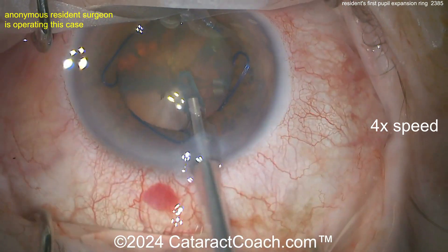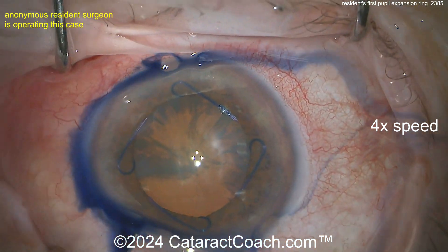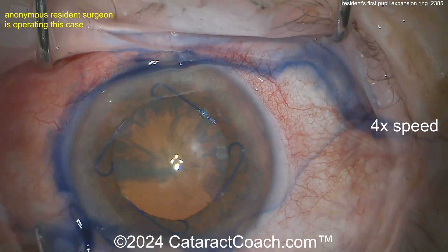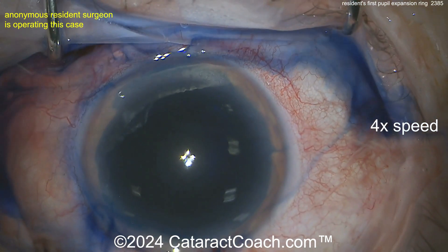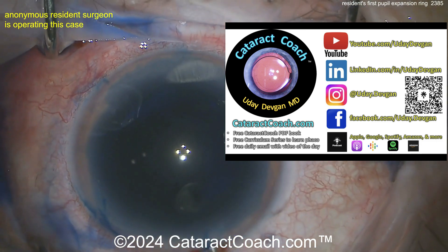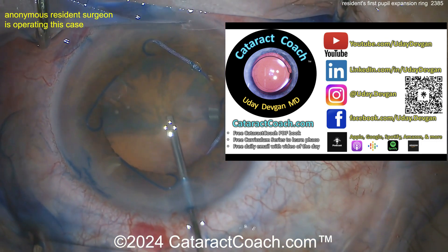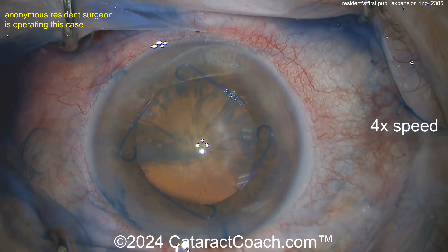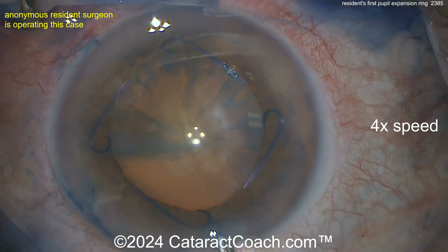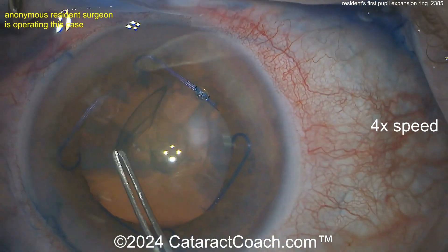You want to learn how to use these devices before you have that really tough case. Now aspirating out the viscoelastic, and you can probably put some trypan blue dye in there — there it is. Remember, if you're a young resident or registrar, there's a whole series of things for you on CataractCoach.com, including a free PDF book. You'll have to leave YouTube for a minute and go to the actual CataractCoach.com website — a ton of free resources just for you.